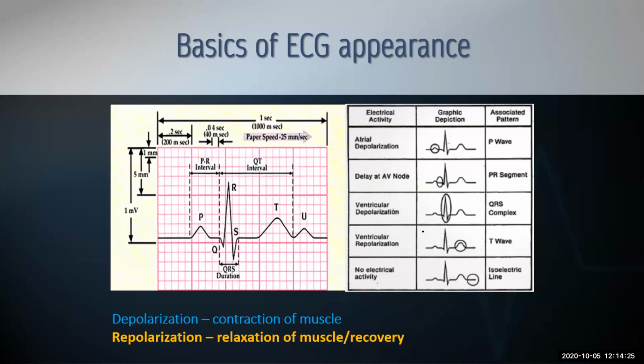So I'm not going to go over this slide on the right side, but you can just see everything I just mentioned: the atrial depolarization, the delay in the AV node, and then how it progresses over. And then again, knowing this is going to help you understand where the pathophysiology is happening, as well as potentially where QRS or electrolyte abnormalities are happening too. I forgot that I put the animation there. Actually came out pretty good. I tried to draw it myself. So you can see that blue, the depolarization, and then the repolarization is going to happen with the yellow.